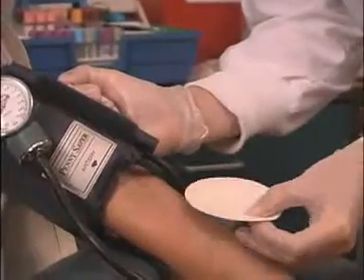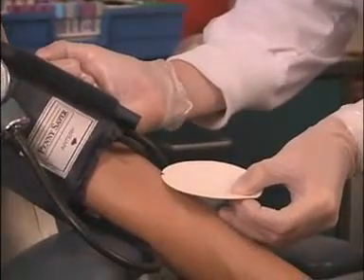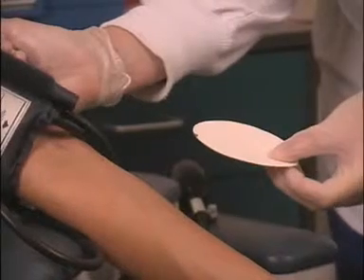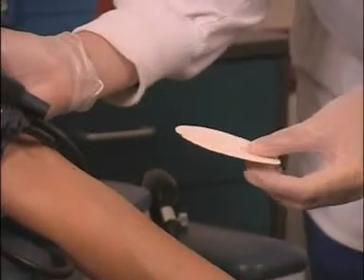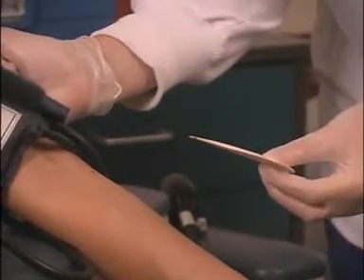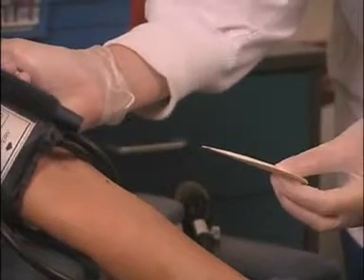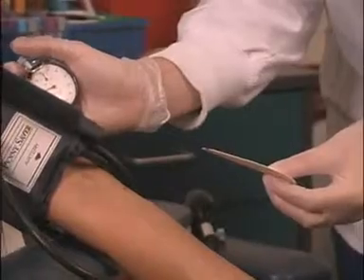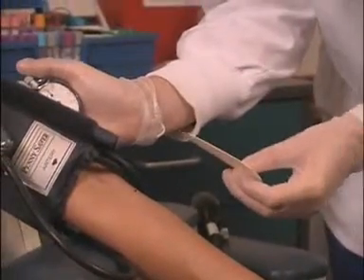Blot the blood flow at 30 seconds by bringing the filter paper close to the incision and absorbing or wicking the blood onto the filter paper without touching the wound. Touching the wound will disturb platelet plug formation. Continue to blot every 30 seconds until blood no longer stains the filter paper. Stop the timer and record the time to the nearest 30 seconds.